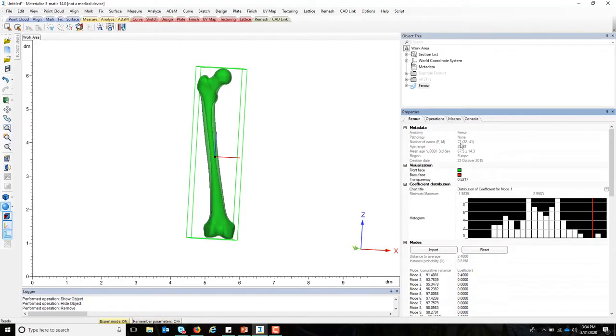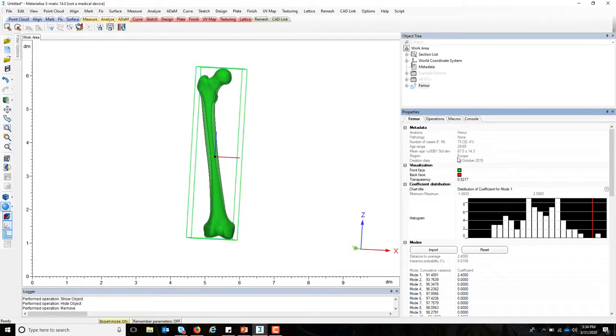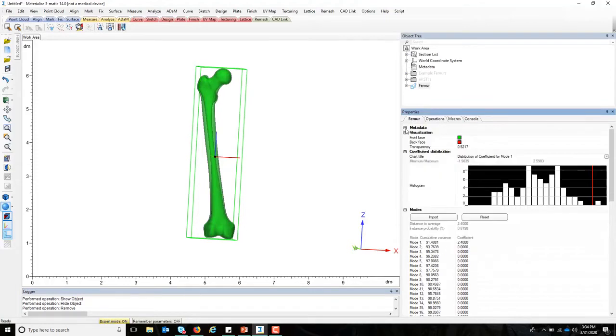As I mentioned before, there are 73 different cases that have gone into building this one single shape model, and it also explains the age range as well as the region of the world where the scans were collected from.